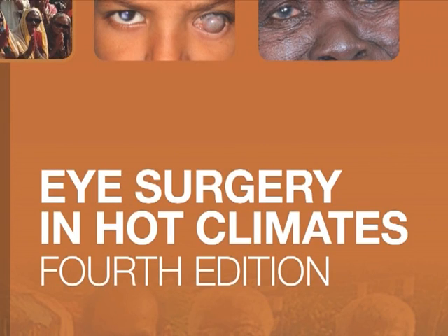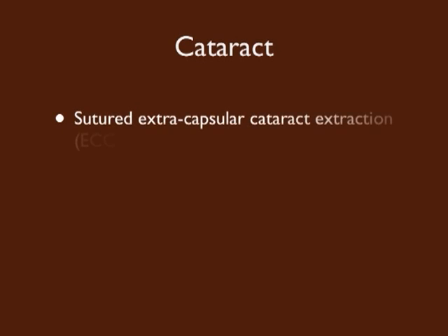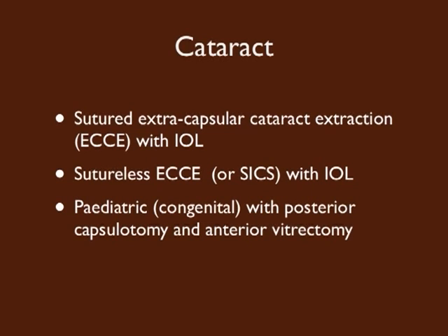Chapter 6 is the largest chapter in the book, and we recommend that you read this thoroughly. The aim of this DVD is to show in video the main parts of the procedure of: firstly, sutured extracapsular cataract extraction with intraocular lens implant; then sutureless extracapsular cataract extraction also with an intraocular lens; and finally, paediatric cataract surgery with an intended posterior capsulotomy and anterior vitrectomy.